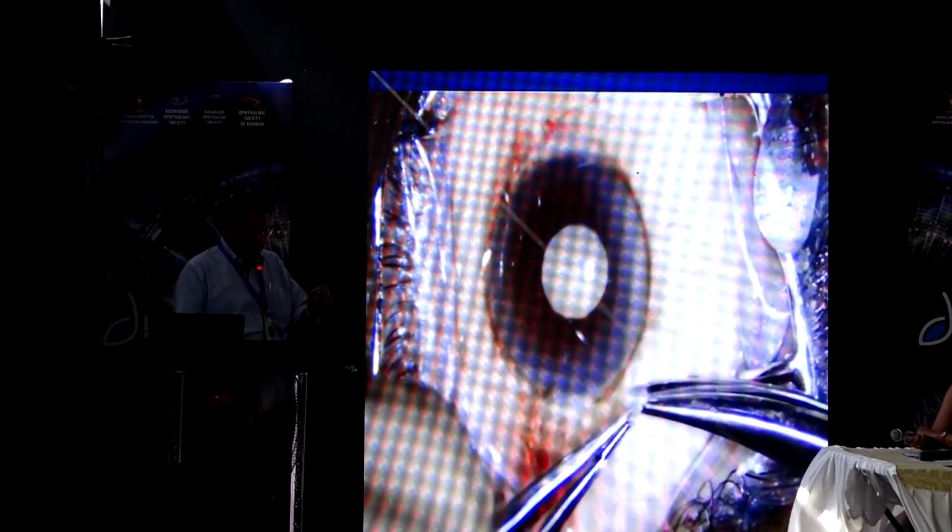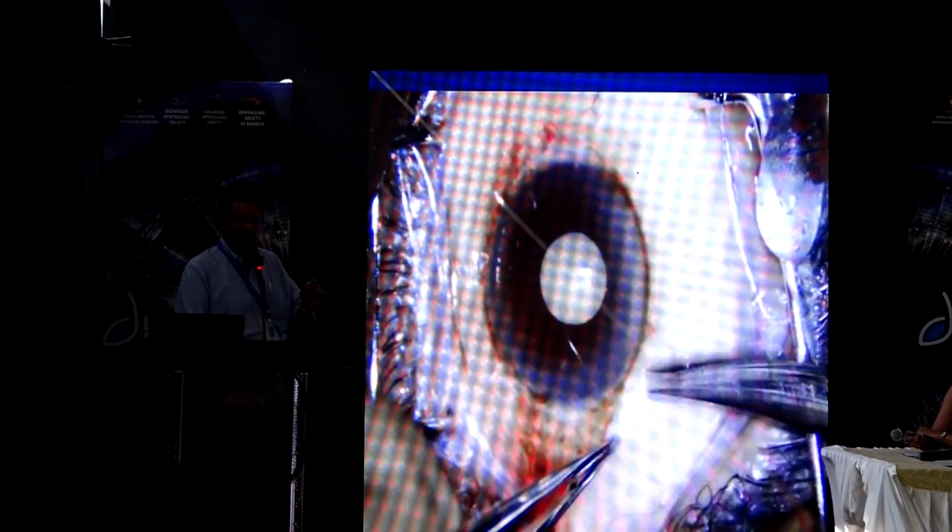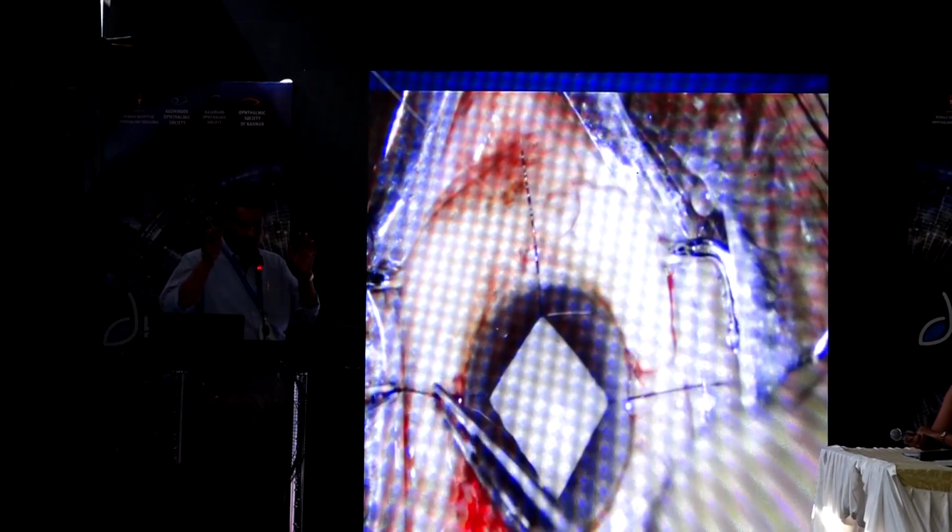So just the last one on SICS. With hooks you can do SICS also. Visibility is the key.